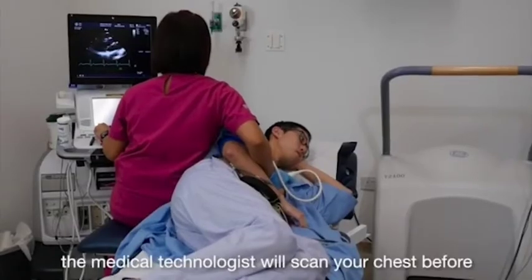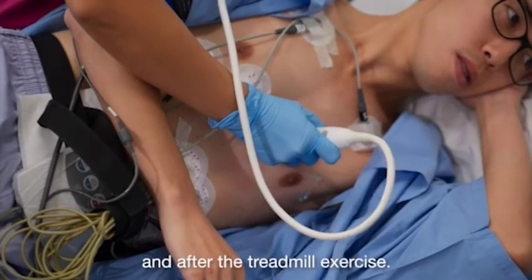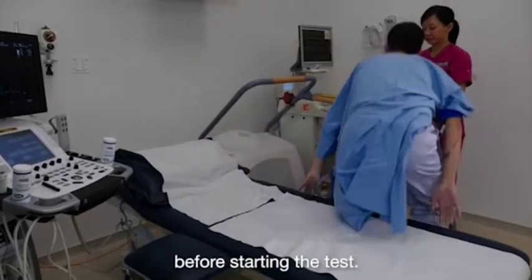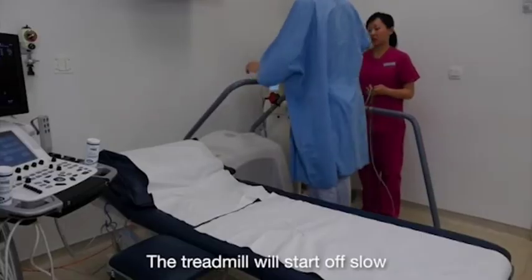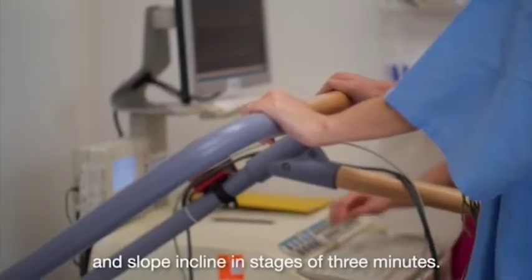During the test, the medical technologist will scan your chest before and after the treadmill exercise. The medical technologist will guide you on how to walk on the treadmill before starting the test. The treadmill will start off slow and gradually increase its speed and slope incline in stages of 3 minutes.